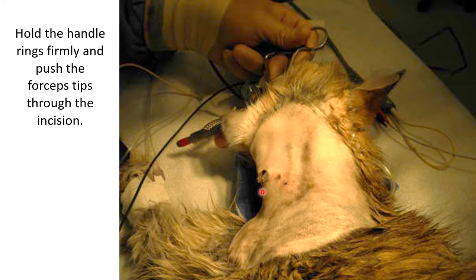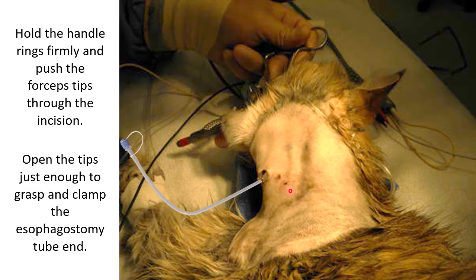I put emphasis on pushing the forceps because you don't want to make an incision which is bigger than the tube you are going to place. Now, once the forceps tips are out, open the tips. Now you can unlock the locks and open the tips just enough for you to grasp and clamp the distal end of the esophagostomy tube.